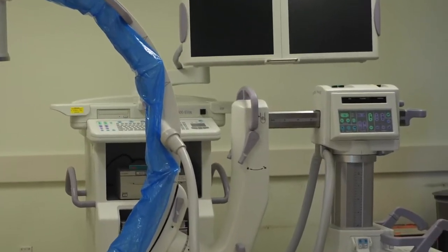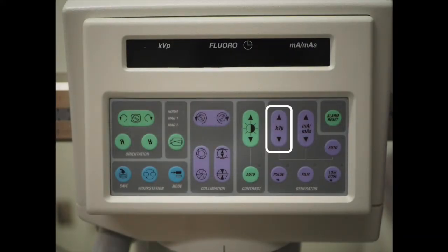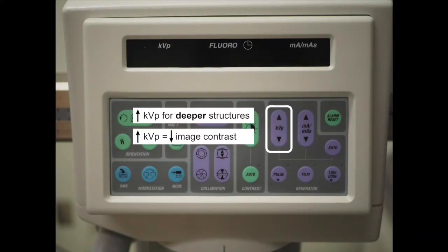Now let's take a closer look at the C-arm control panel. KVP is the voltage or tube potential. Increasing the voltage increases the penetration of the X-ray beam, which can be helpful when viewing deeper structures, but actually reduces image contrast.